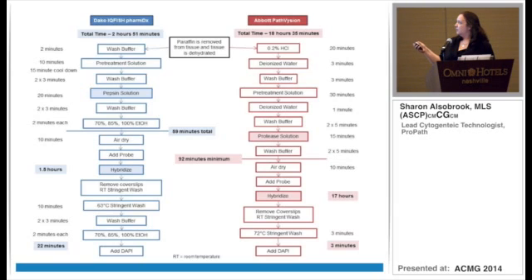one little caveat about this total time is that's at the minimum starting at the breast standard, which is why this says minimum here instead of the full range. Again, for GIs, you're going to add 45 minutes minimum onto that. So this is extremely dependent upon tissue type. Whereas over here, again, everything goes in together. There's no variation based on tissue type. So in 1 hour hands-on time, we're ready to probe, and we're ready to move on.